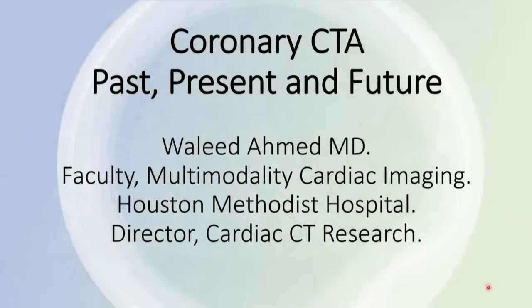The topic today is a huge topic, coronary CT. And I thought I will break it down into past, present, and future. My goal is to really give you all a good appreciation of the key CT literature that most of us should know with regards to coronary CT. A lot of it is very bread and butter stuff that we talk about every day.